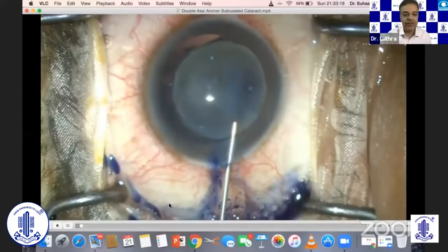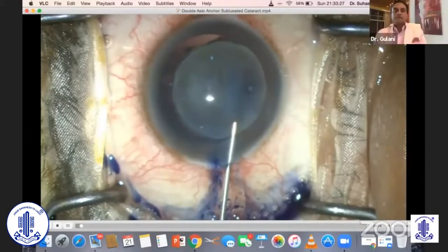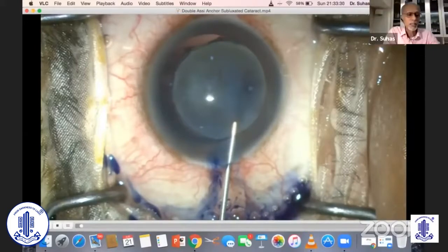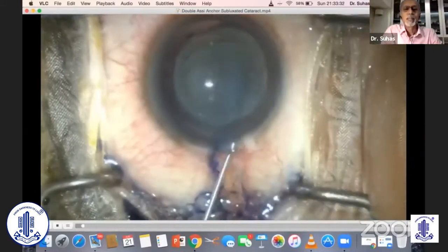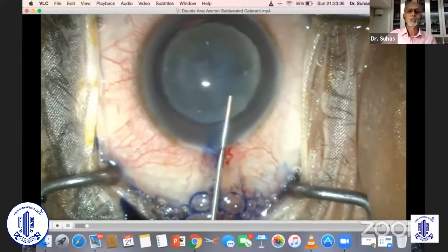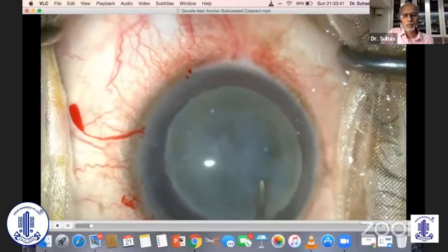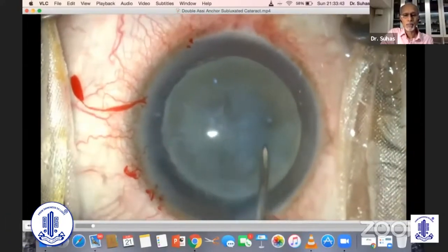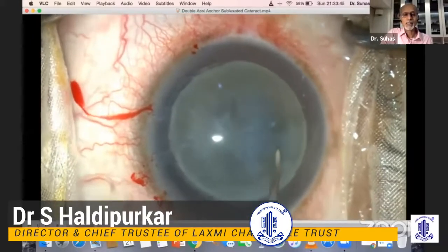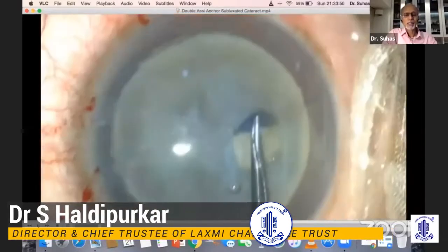This is a case of advanced subluxation. If you notice, the cataract is literally hanging on a few zonules — it's a very advanced cataract, so it certainly requires a lot of planning. One thing that's in your favor in such a case is that there's no vitreous in the anterior chamber.